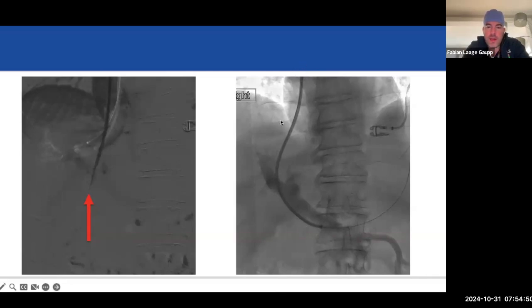By the way, often when you have a really cirrhotic small liver, it can be very tough tissue, so even getting your sheath down can be quite difficult. Sometimes you need to pre-dilate the tract, right? I usually use a 6 mm balloon. I open this up, and then I get my sheath down.